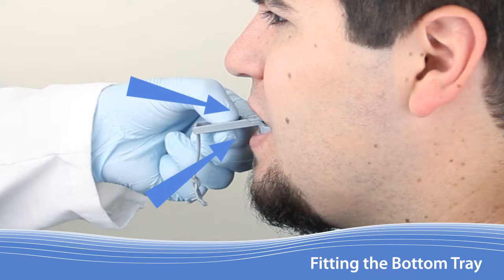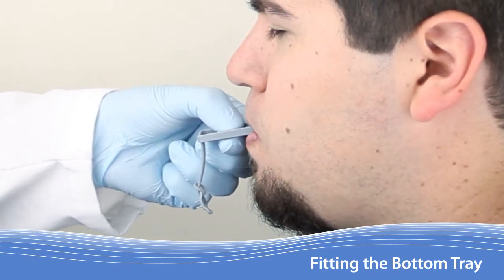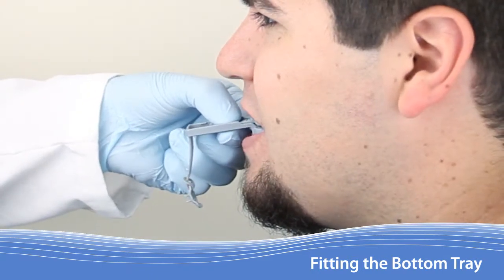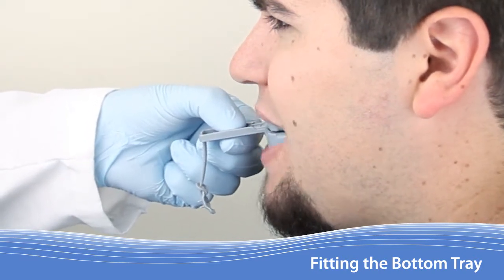The trays should be held lightly in place so they can slide freely. Ask the patient to relax their cheeks and lips around the Apnea Guard and then tap their teeth a few times to allow the jaw to settle into the neutral position. Now look down on the handle and note the first number visible at the edge of the top tray. The correct fitting setting is the first fully readable number — for example, 7 if it is fully readable and 8 is partially covered. Repeating the steps to determine the fitting setting once or twice is recommended until a consistent result is achieved.